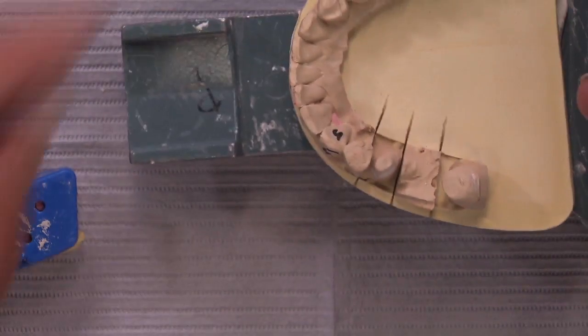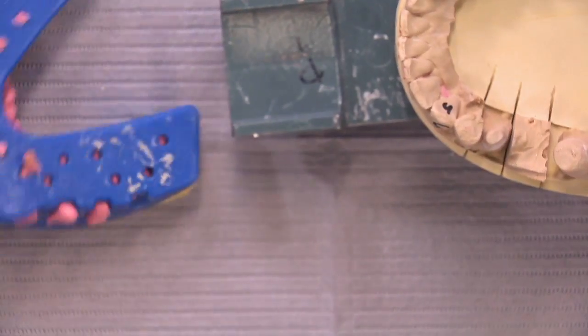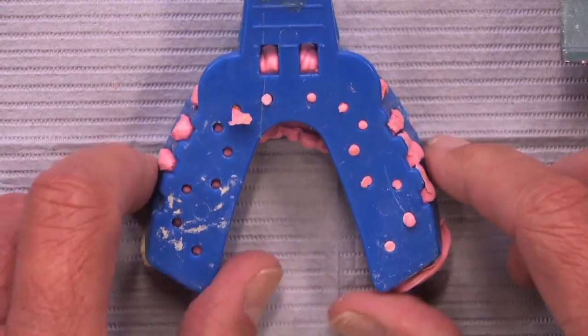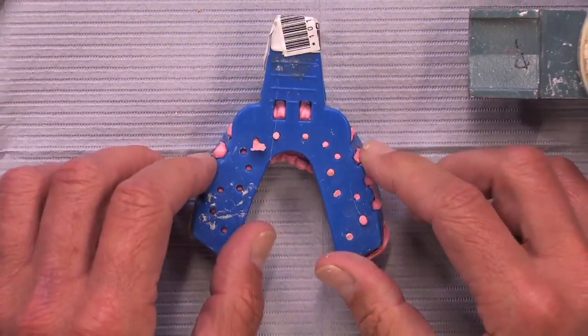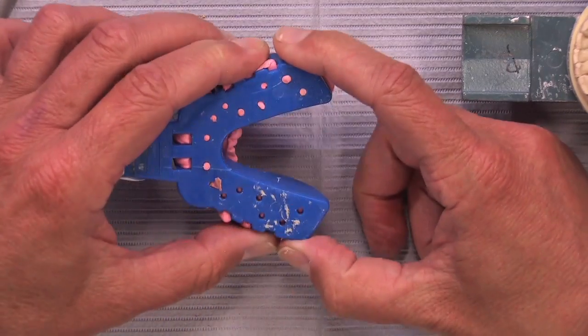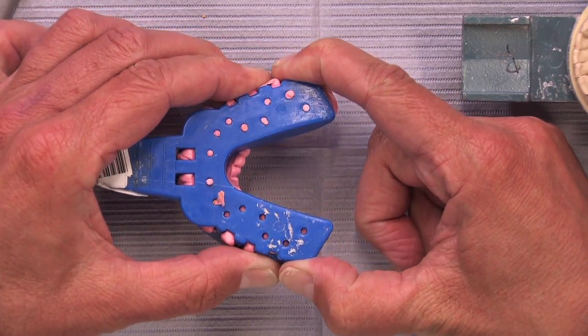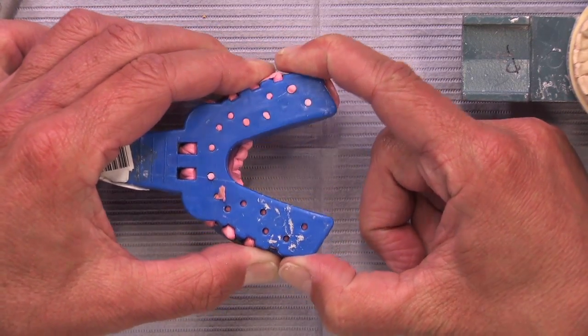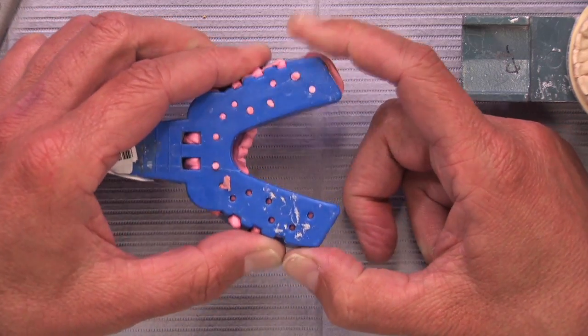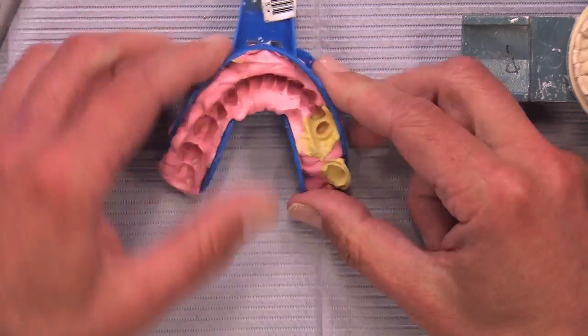That's really not even the point of what I wanted to show you of this. It was the impression itself. As we pull out a little bit and look at the impression, this is what we got from the doctor. So it's a full arch tray. That's nice. I like metal trays, but if I try to squeeze this plastic one, I'm squeezing pretty hard and I'm really not getting any movement. So it's a nice stiff tray, so we can't complain about that.